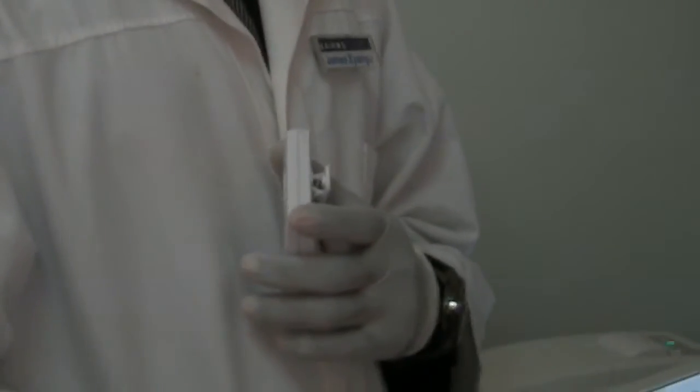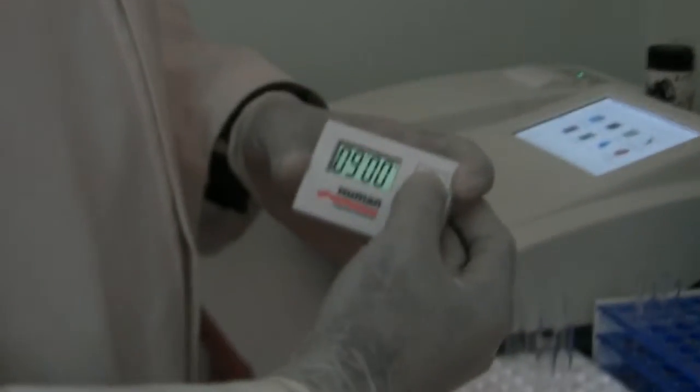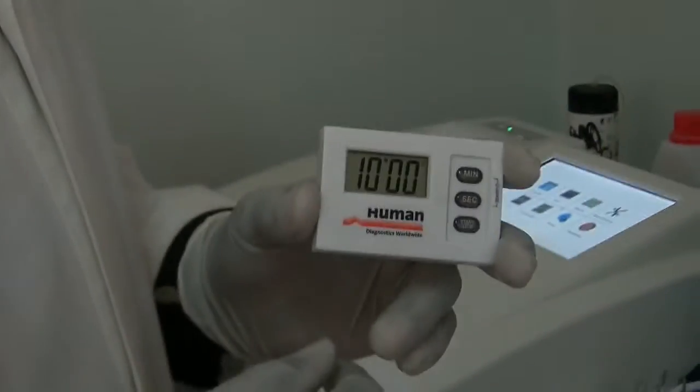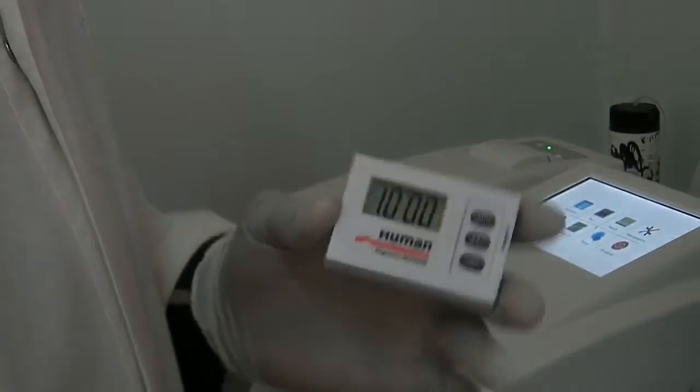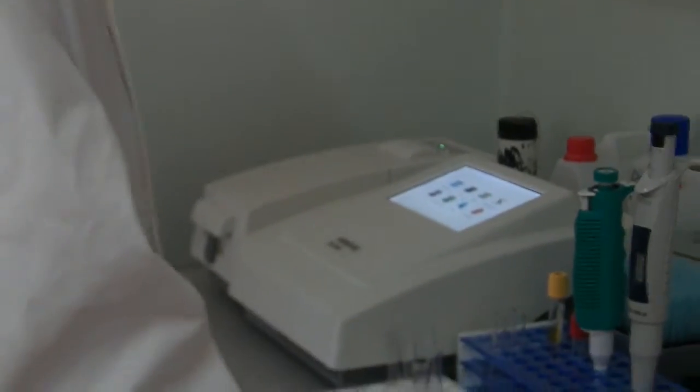Now, we're going to introduce this into the mixture. We have a timer here, we are going to time this for 10 minutes. So we're going to have this mixture, we're going to have it incubate for at least 10 minutes, and after the 10 minutes we can run the test, it will be ready for the test.